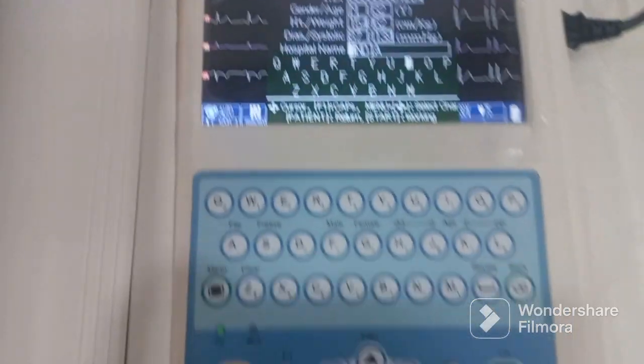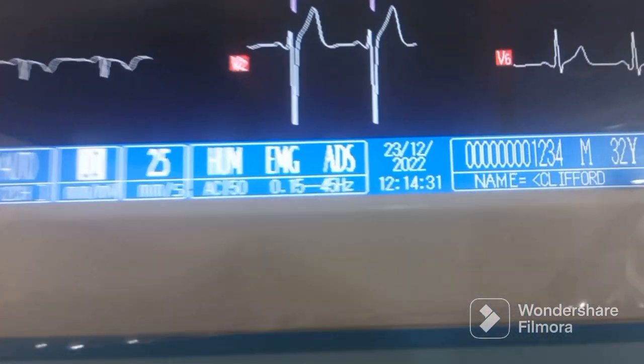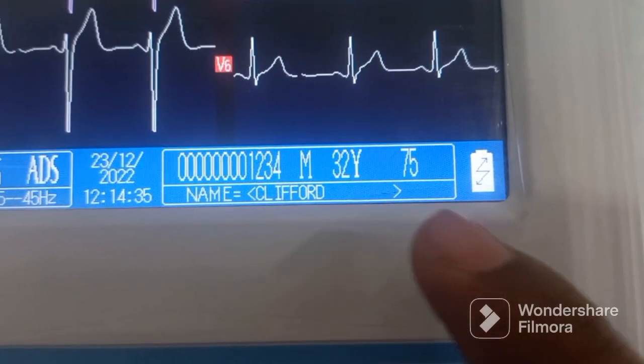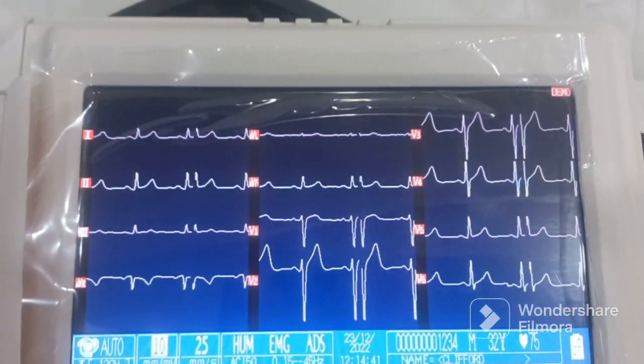Once everything is done, press the patient button again and all the data will be saved automatically. At the display you can now see the name, the ID, male, 32 years — all the data has been fed into the machine.